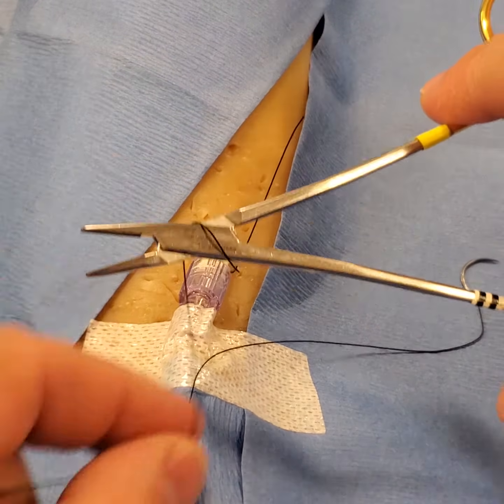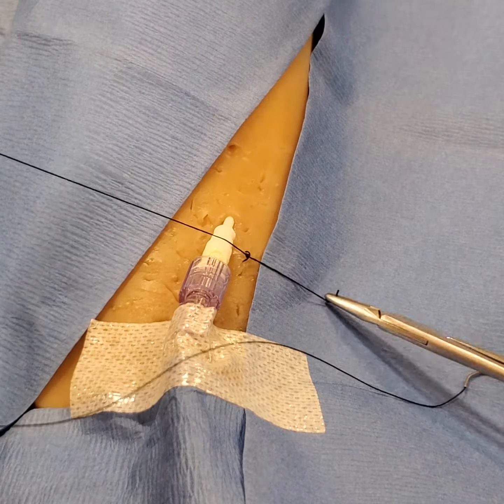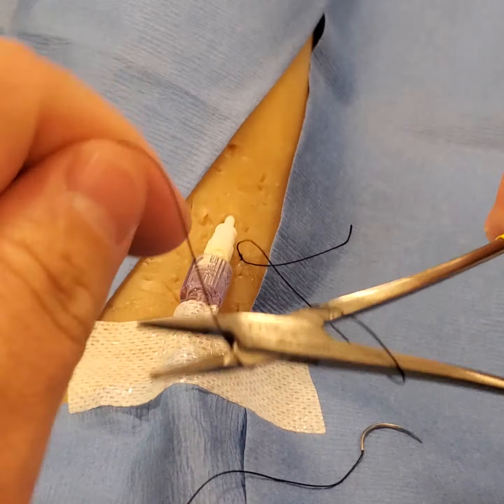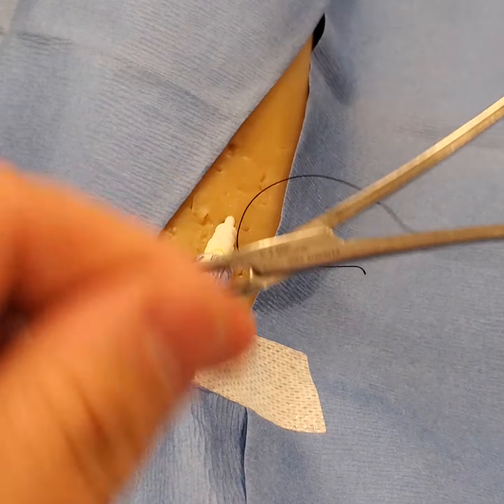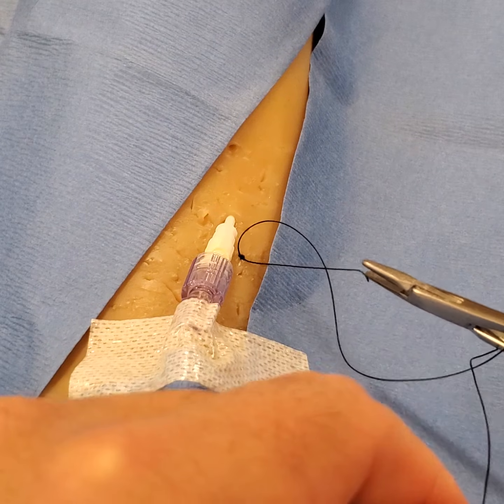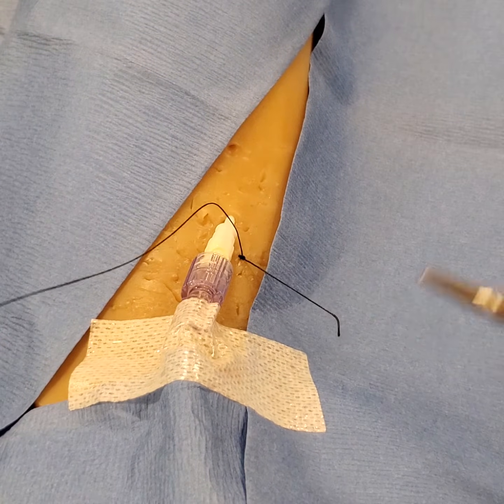The knot sequence goes three, two, one — then one, two, three — then two, and one. That's your one anchor point.